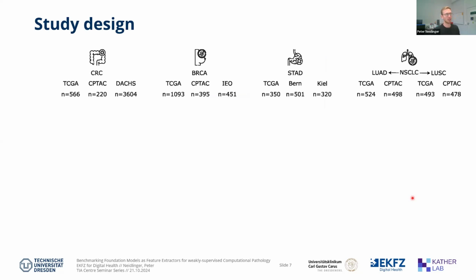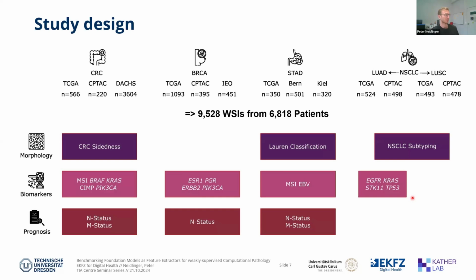And in total, we had 9,528 whole slide images from 6,818 patients. And we decided to test them on multiple tasks. The main focus was biomarker tasks.